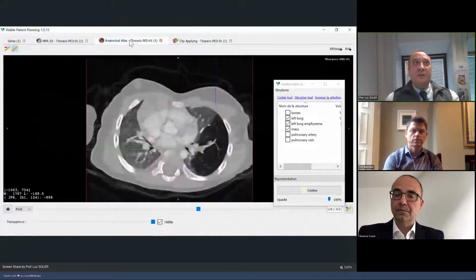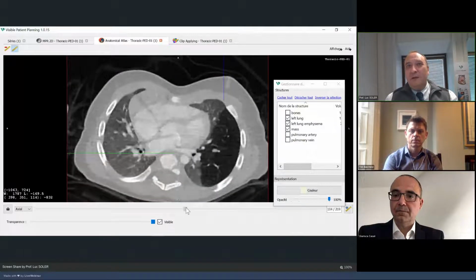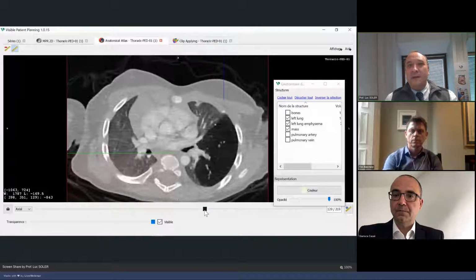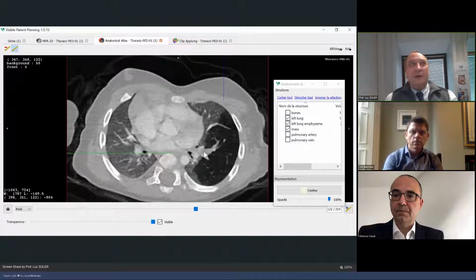If I check now the medical image with the colorization, you will see that indeed we have here the bronchus tree, the classical bronchus tree with dark colors, dark gray levels due to the air inside. But we have an additional tree that is not visible immediately with my eyes, that a computer can compute, and that appears in pink.